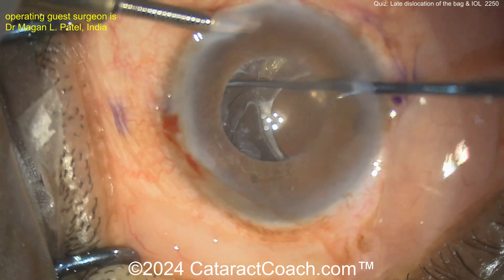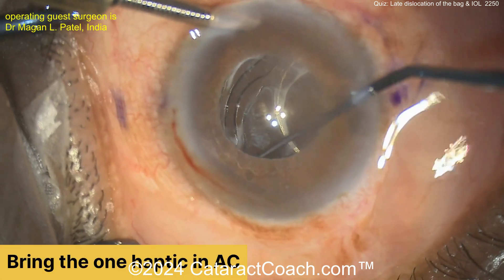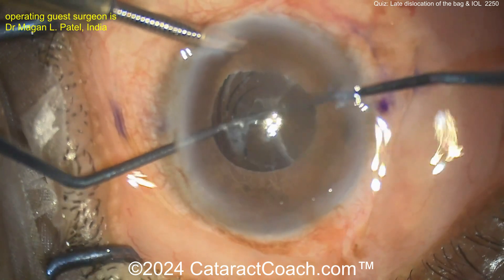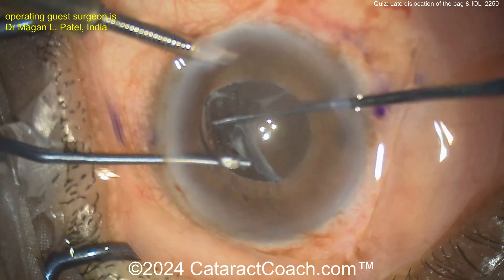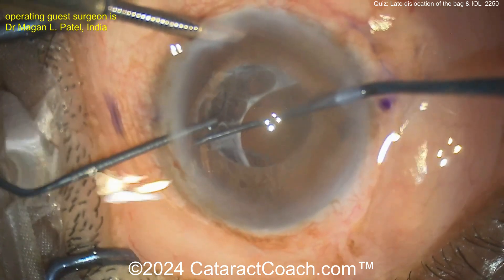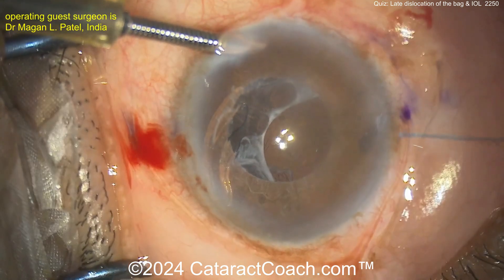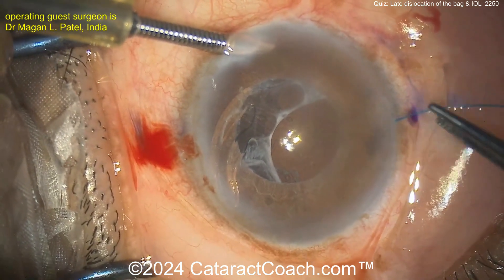Going in here — let's not let this lens fall back. Getting the lens up so you can bring that one haptic up into the anterior chamber. There we go. Once that one haptic is up in the AC, you can do a belt loop type procedure. The belt loop procedure uses a prolene suture, usually 6-0 polypropylene.